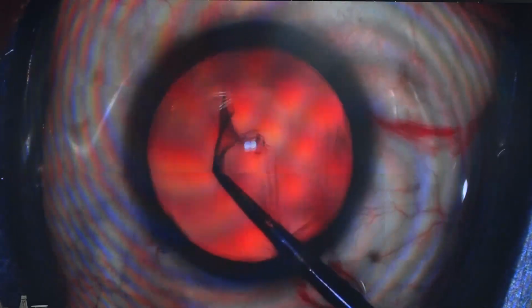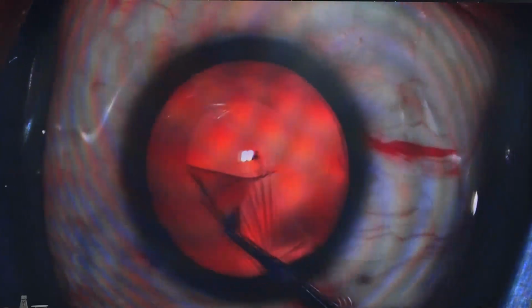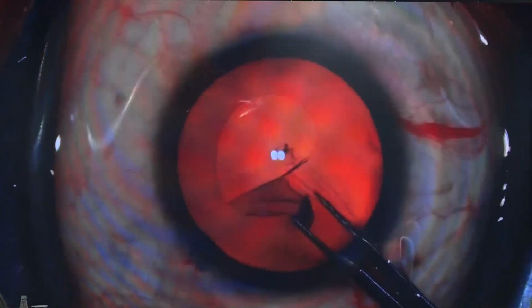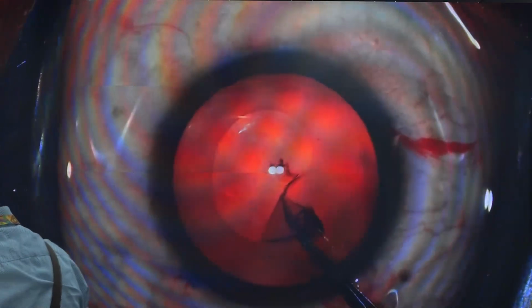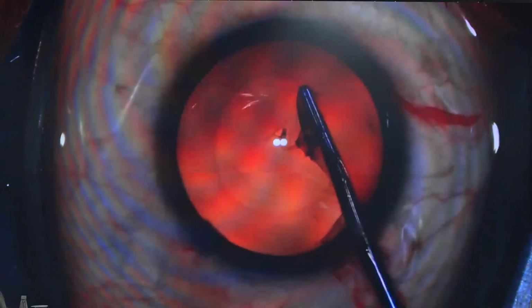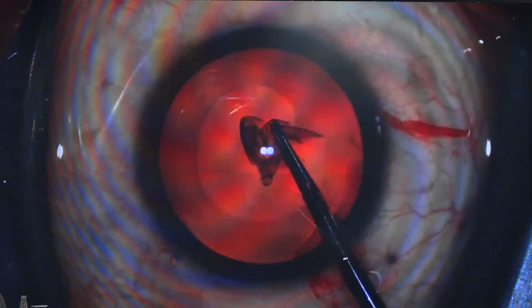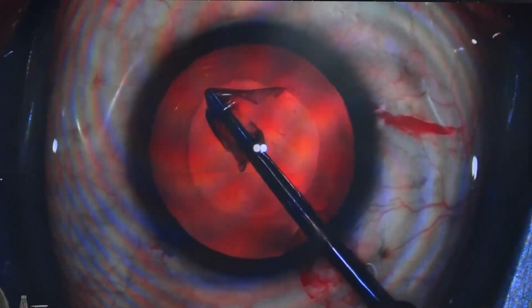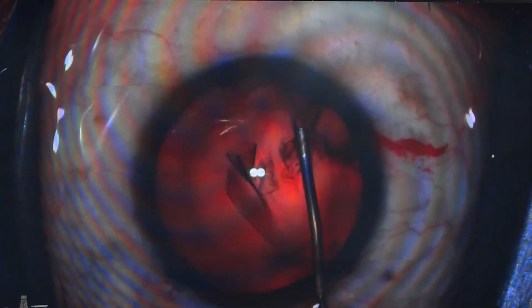So as I said, the red glow is excellent in high myopes, but your rhexis tends to be larger than what you had aimed for. So the movement of the viscoelastic should be heavy. I prefer 1.4% sodium hyaluronate, and the movement should be towards the roof of the cornea so that you achieve a 5 to 5.25 millimeter rhexis.